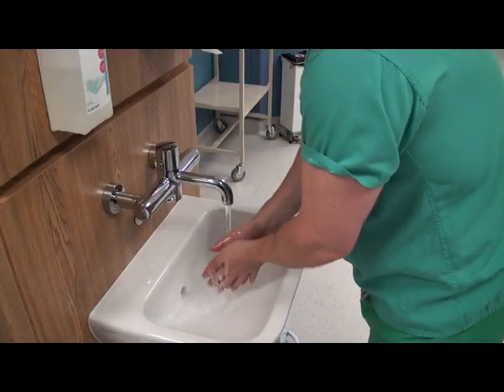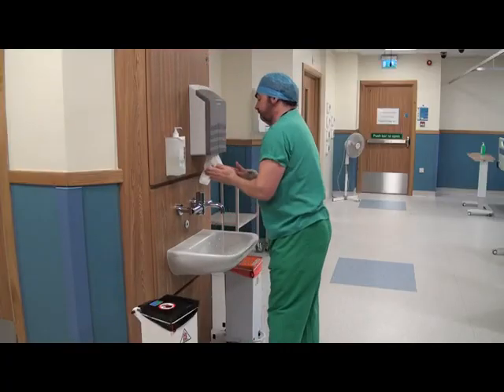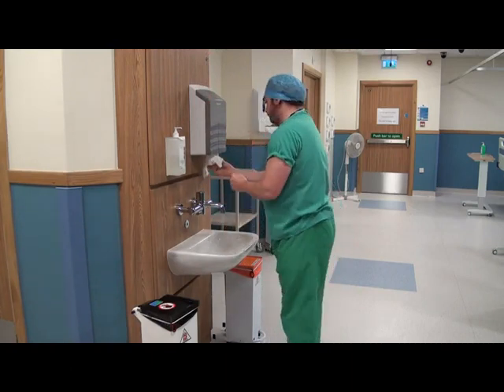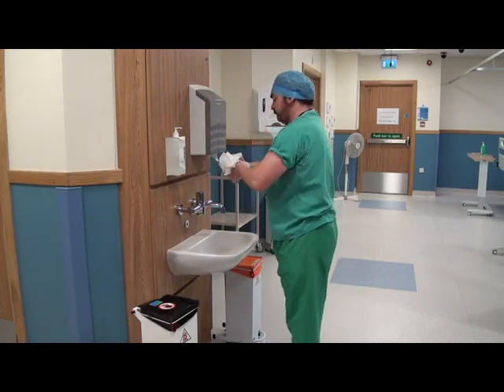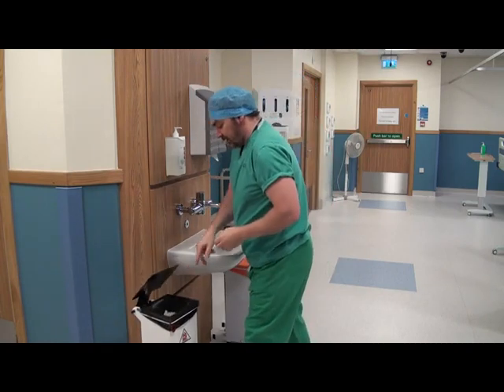When entering the patient zone, hands must be decontaminated before each episode of patient care. Liquid soap or hand gel should be used. At the sink, a paper hand towel should be used to thoroughly dry your hands and carefully disposed of into a waste bin.